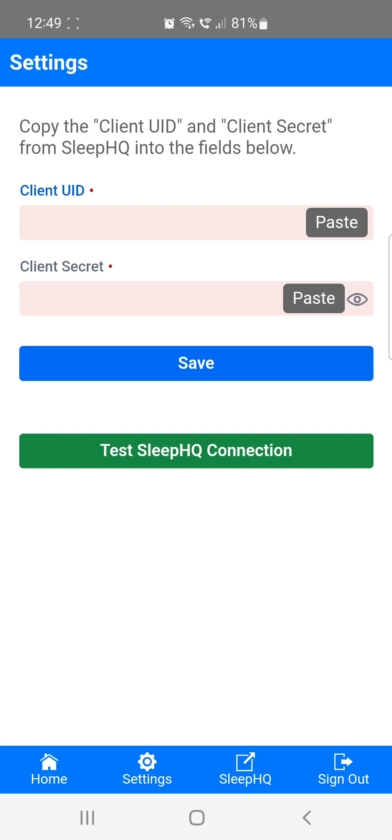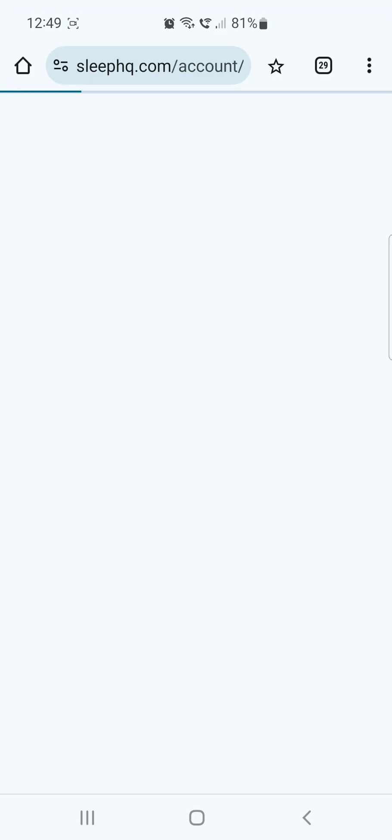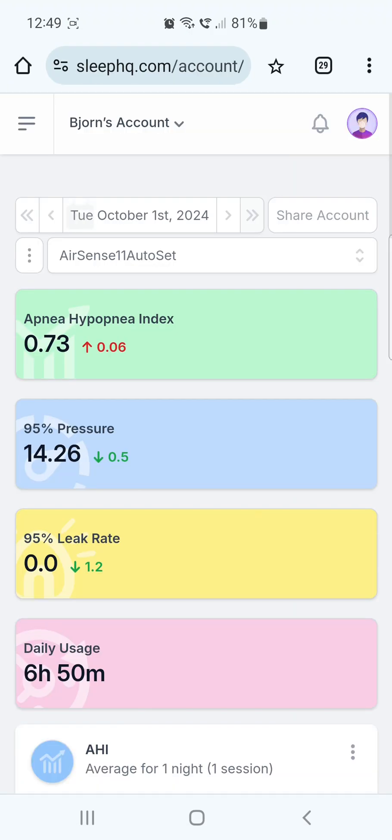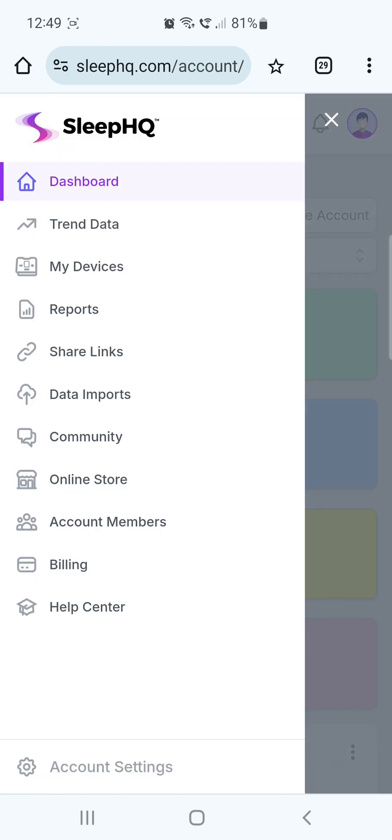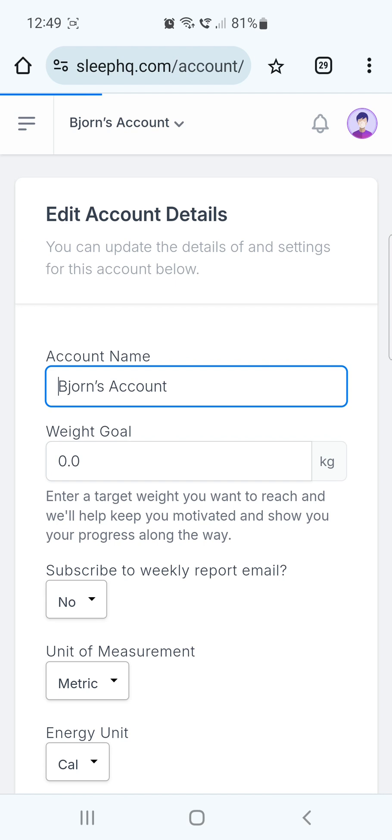To get your API credentials from Sleep HQ, I'll switch over by tapping the Sleep HQ menu item at the bottom of the screen. Now, in Sleep HQ, open the menu and select Account Settings at the bottom.